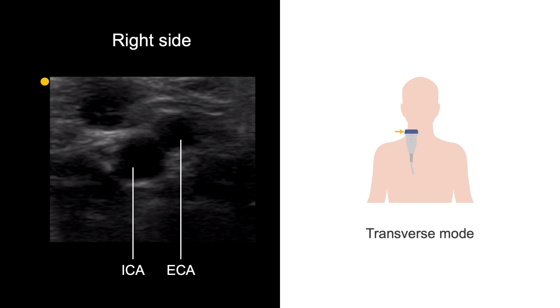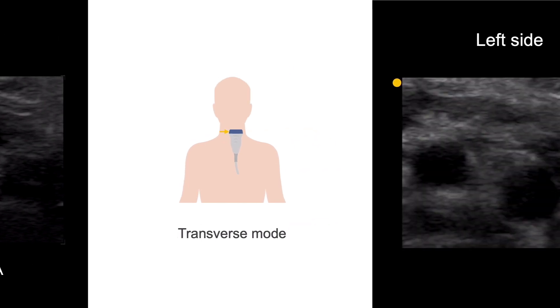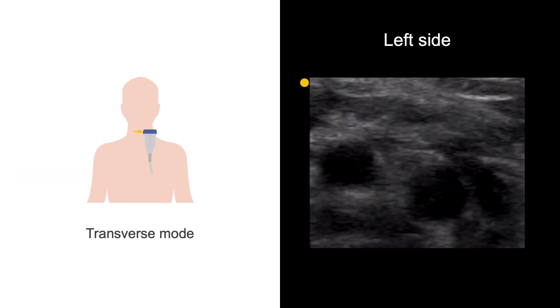The artery on the right side of the image, that is the medial side of the neck, is the ECA. When performing an ultrasound on the left side of the neck, the larger, deeper artery on the right of the image — that is the lateral side of the neck — is the ICA. Again, the artery on the left side of the image, that is the medial side of the neck, is the ECA.